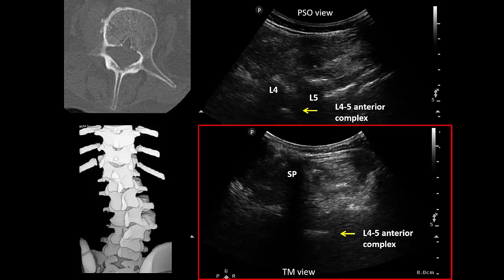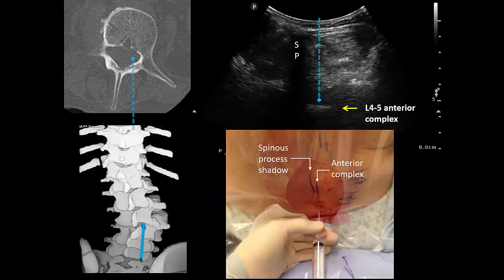The transverse view at the L4-5 level is very interesting, and is something we often see in patients with more severe degrees of scoliosis. The anterior complex is located to one side of the spinous process shadow, in this case the right side. We know that this is the anterior complex because it is a shadow located at the same depth as the anterior complex in the parasagittal oblique view. What we are seeing is a paramedian view into the vertebral canal with the ultrasound beam traveling vertically into the canal and back out again. This means that we can insert a needle perpendicular to the patient's back directly in line with the anterior complex, and it will penetrate the epidural or intrathecal space. I have used this approach in many patients successfully.